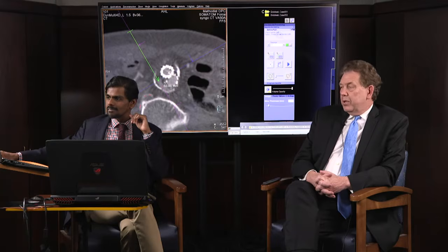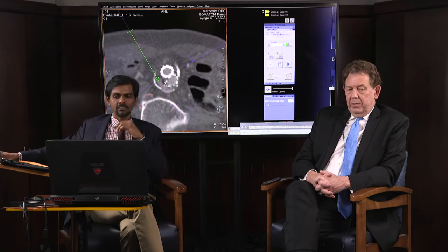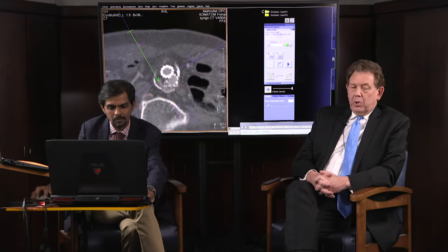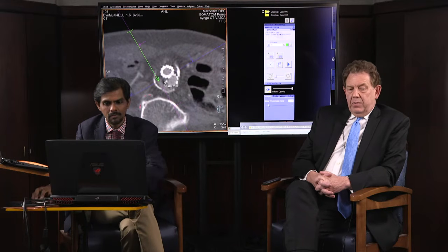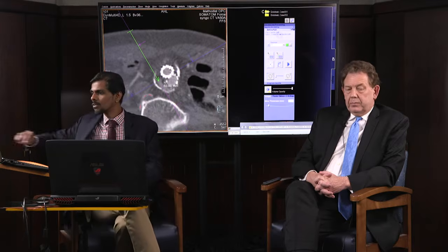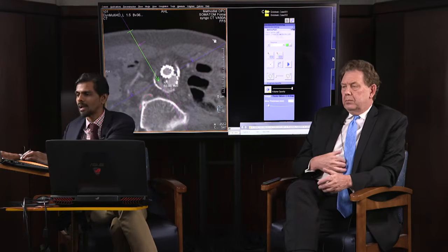That green line, once it's fused, is pushed up into the image intensifier, in this case the X-ray for the image. Now, if you were standing looking straight down that line, that's what's called bullseye view. And Ponraj can tell the machine, the image intensifier, to look straight down like you're standing on the end of that green line.